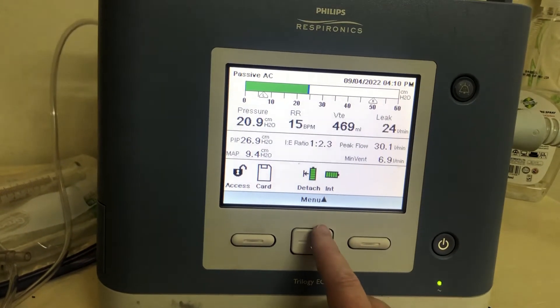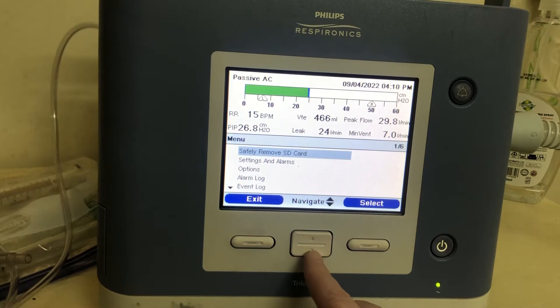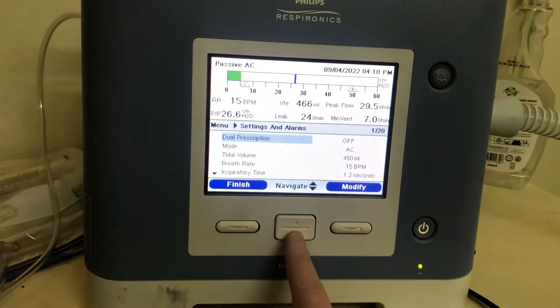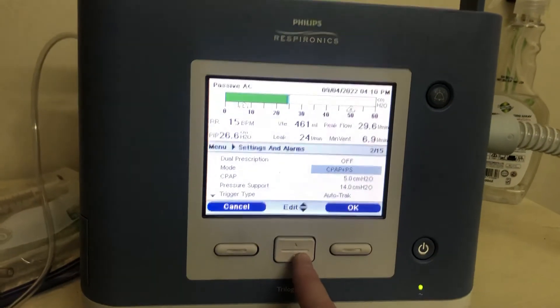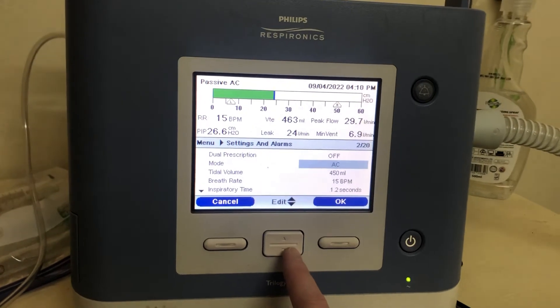If you want to change any settings, hit up to go to menu, then scroll down to settings and alarms and select. It's not a touchscreen, so you just scroll up and down. Select mode and you can modify it. You can go to CPAP plus pressure support — this is what you'll use for BiPAP — or SIMV or AC mode.